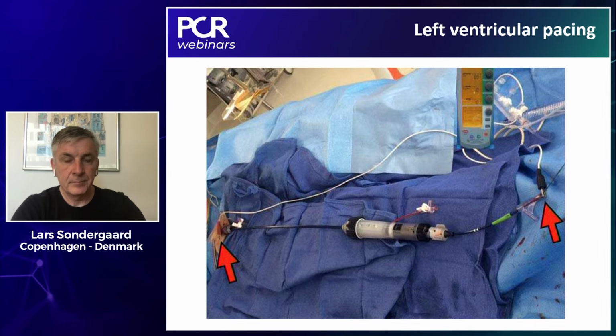Yeah, thanks, Lars. That was an excellent presentation. I thoroughly agree with you about the use of the cusp overlap view to reduce pacing. We've now seen multiple publications with different devices using the cusp overlap technique to promote a lower implant depth in the left ventricular outflow tract below the non- and right coronary cusps, and that for all devices seems to have been very effective in reducing the pacemaker rate.